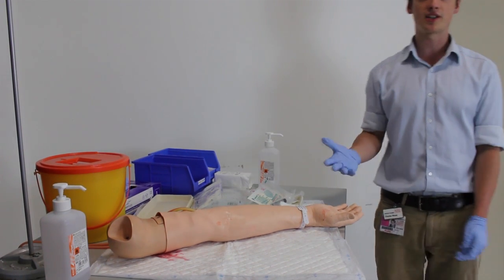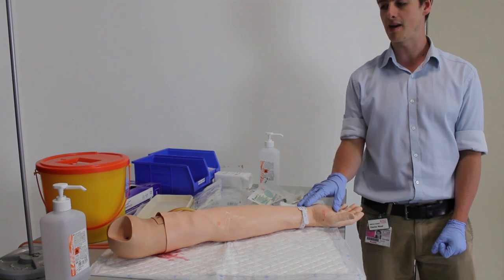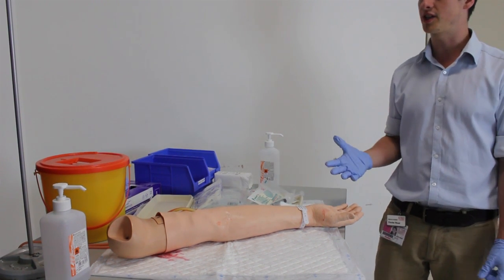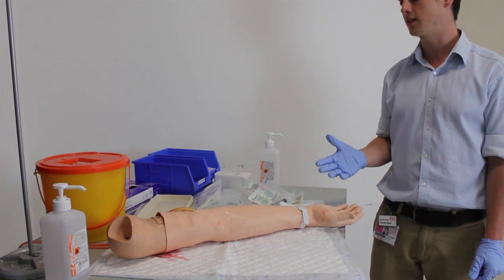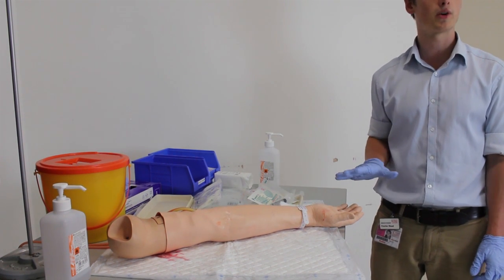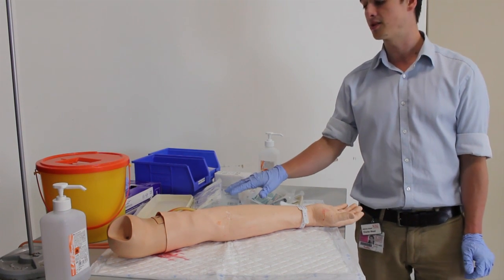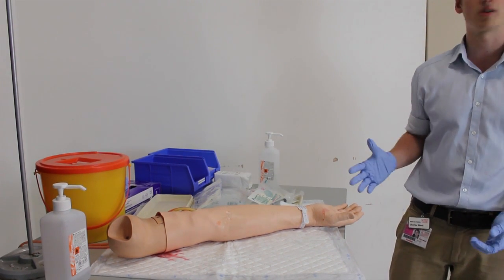It's then good to introduce yourself to the patient, confirm their identity and date of birth using their name tag and by speaking to them, and then explain the procedure — that you've come to put a small plastic tube into their arm using a needle, they'll feel a sharp scratch but it shouldn't be painful, and if it is painful at any point they should tell you and you can stop. Then explain that after that you'll set up some fluids through the drip and they might feel a cool sensation in the arm, but again it shouldn't be painful at all.